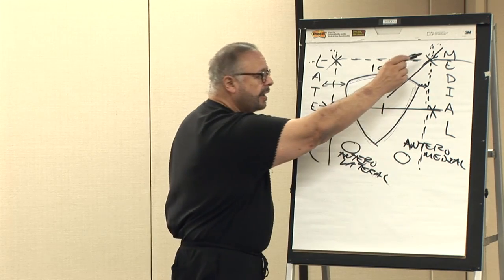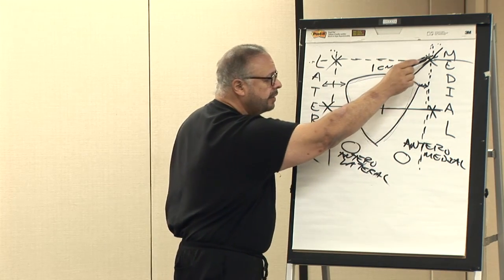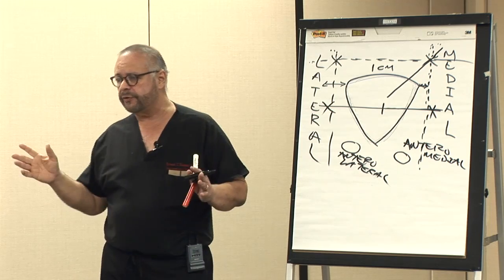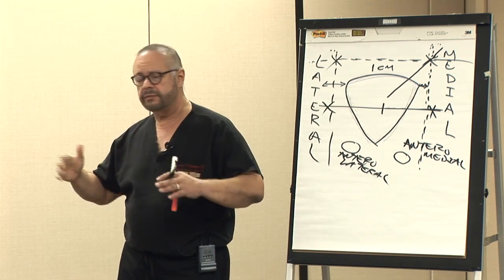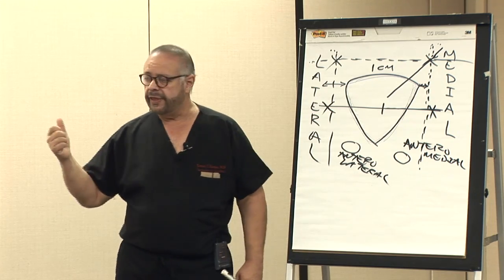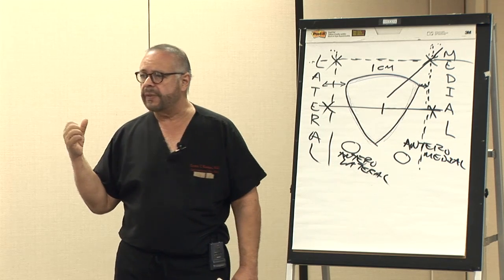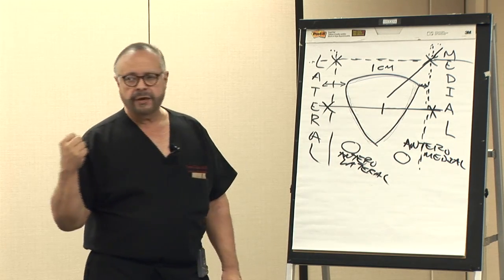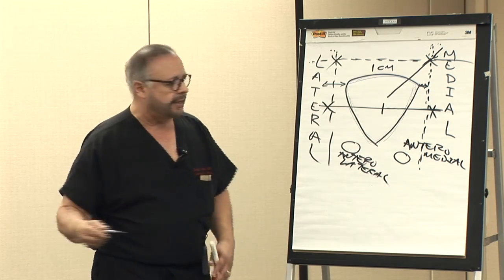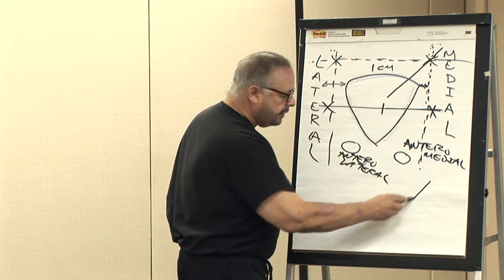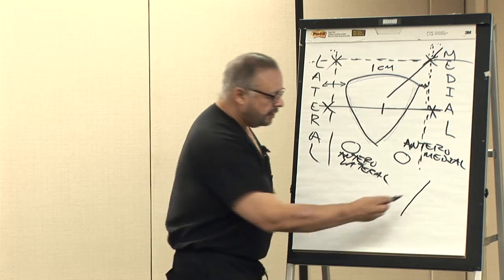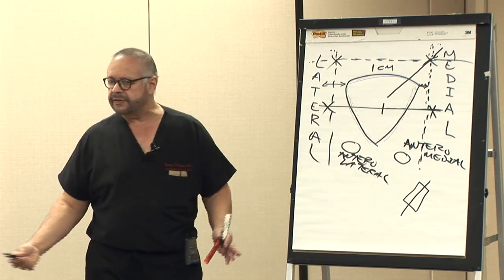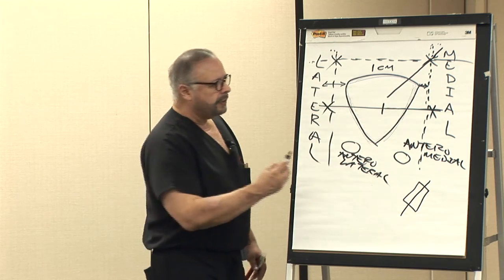What I normally do now is come in with my needle and perform my procedure as I've always done. Then I take my ultrasound probe and put it in-plane. In-plane means that if my needle comes like this, the ultrasound probe is aligned with it. This is in-plane; the alternative is out-of-plane.